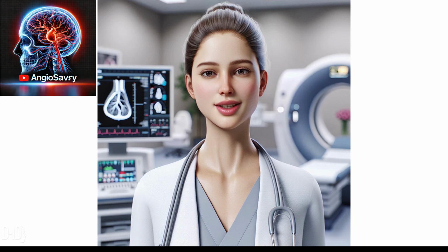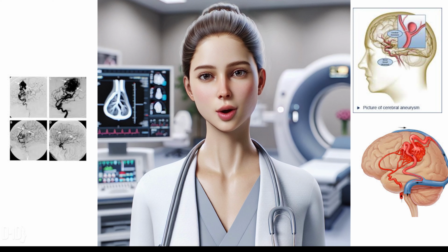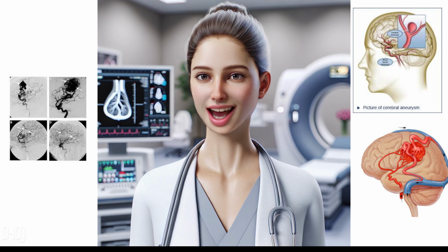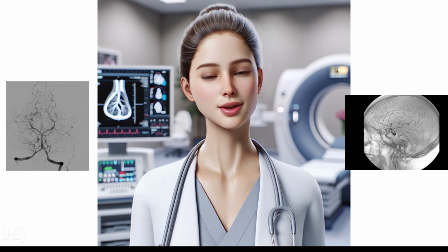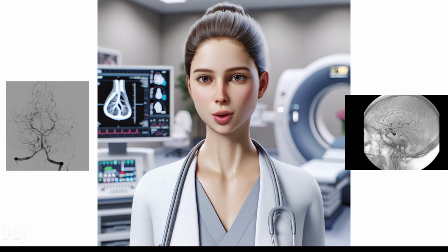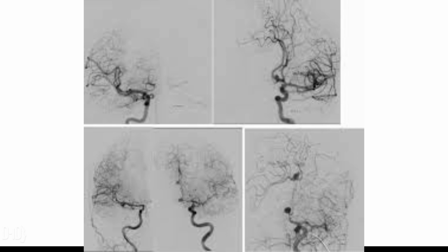So, you have a condition that requires for you to get a cerebral angiogram done for further evaluation or even possible treatment. Have you heard about cerebral angiogram in the past? No worries, I will guide you through each stage of this procedure so you know what to expect and be prepared for this angiogram. A cerebral angiogram is a diagnostic procedure used to visualize the blood vessels in the neck and brain.